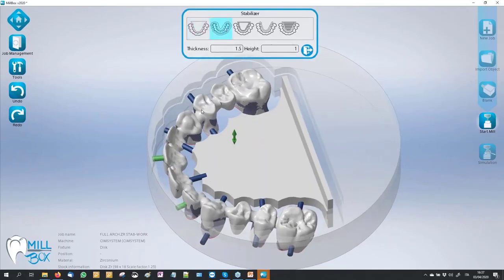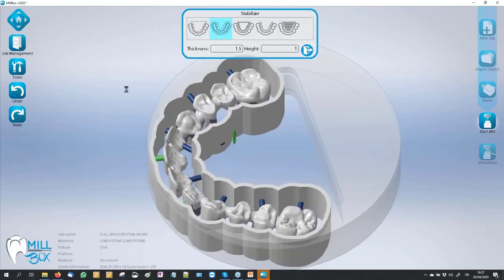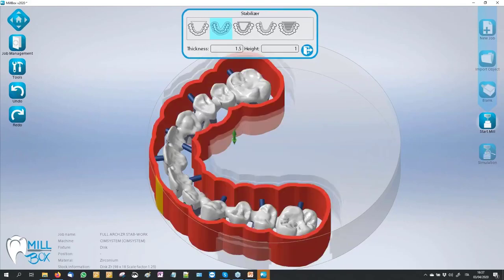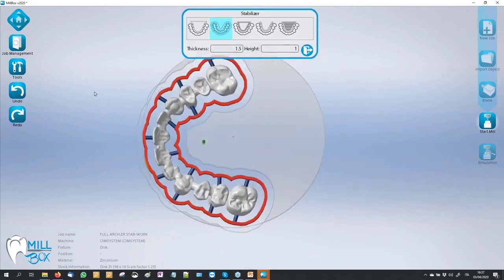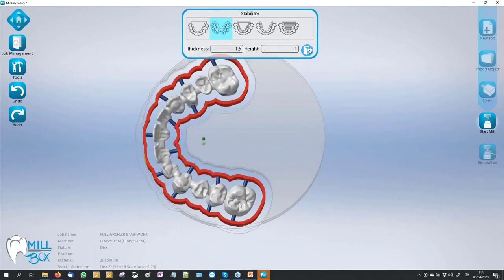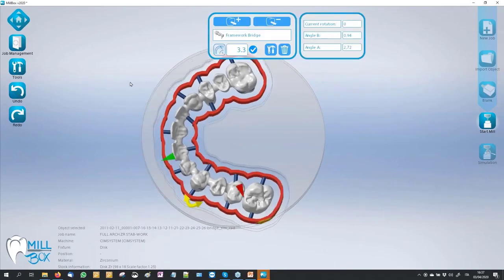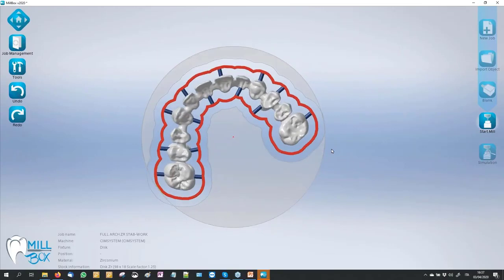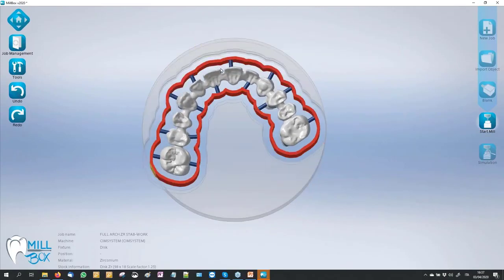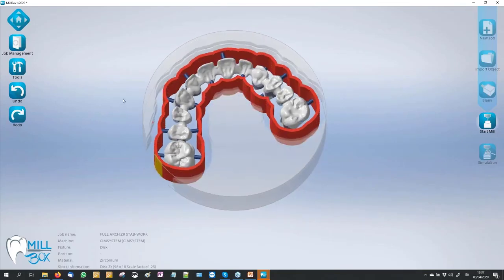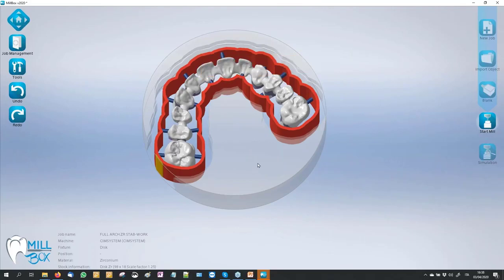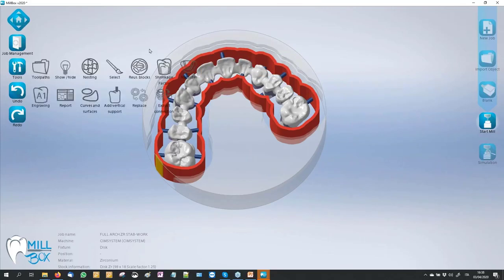We go on with the second stabilizer — this is a bigger stabilizer, very big for this example. Maybe it's much more useful on a large long bridge, but not on a full arch. Just to show you that we have it.